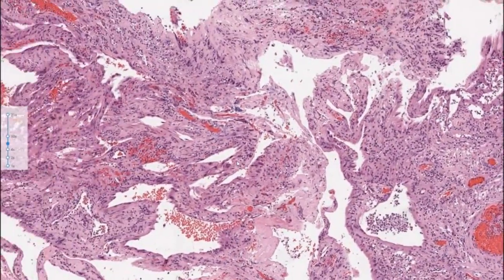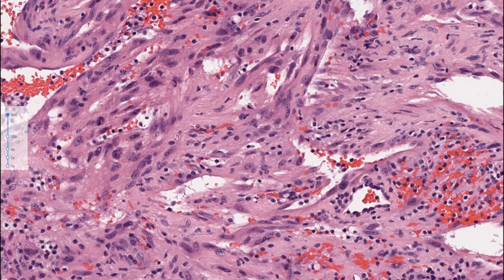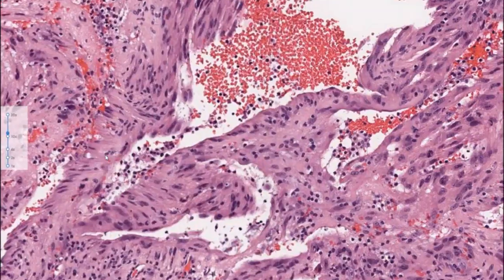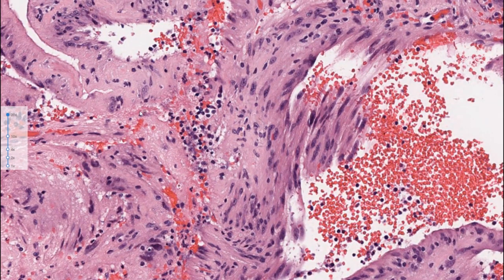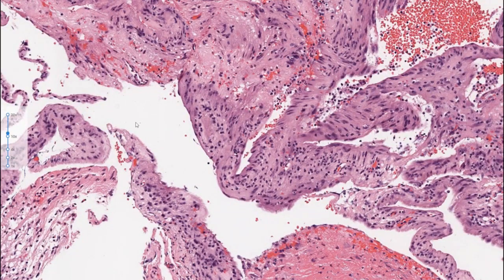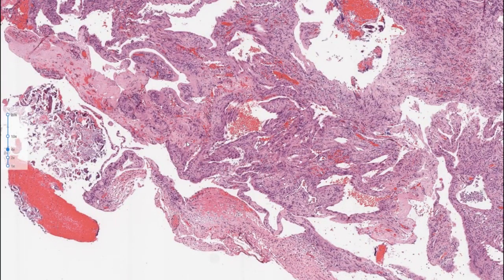So this one is almost given by the perioperative appearance. You do have a bit of nuclear enlargement here, and that is okay. This is the degenerative type of atypia. You see this commonly in tumors of the central nervous system and also tumors of the peripheral nervous system, and it is not to be worrisome for malignancy. It's just something degenerative. You see this chromatin that is a bit smudgy, and in this tumor type, it is sometimes referred to as ancient change. Here you also have some cystic change, but not a cystic lining. That's also very characteristic, and goes well with that imaging finding of some cysts.